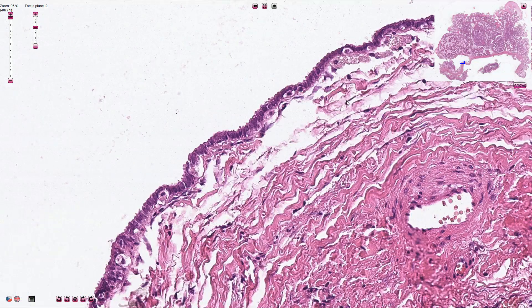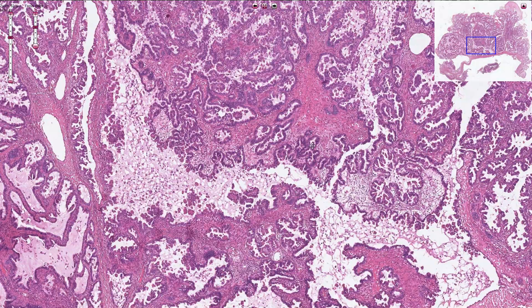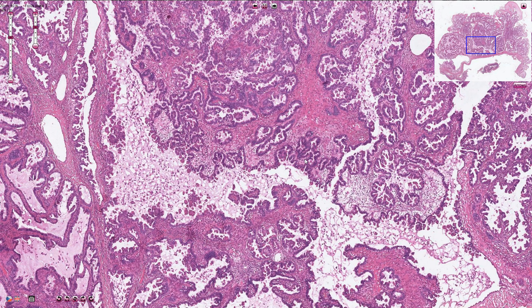A cystic ovarian tumor lined by only this type of epithelium could be called serous cyst adenoma. However, in some other parts of the tumor we can recognize papillary structures composed of hierarchically branching papillary components. Invasive type of growth is not found, and therefore this is the typical appearance of serous borderline tumor, also called atypical proliferative serous tumor of the ovary.